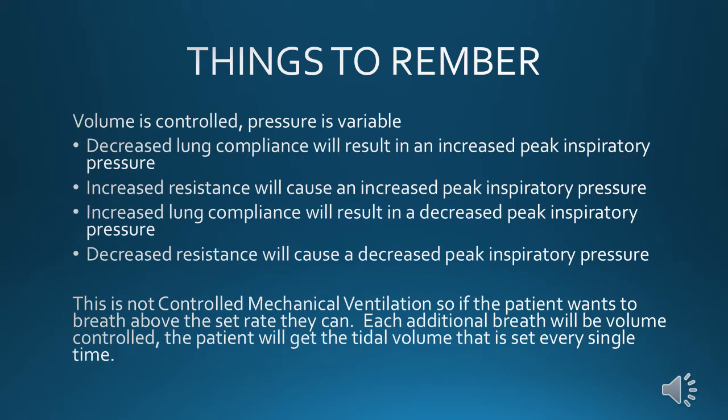Also remember, this is not controlled mechanical ventilation. We talked about this, I believe, in the very first episode. This is not CMV. So if the patient wants to breathe above the set rate, they can. Every additional breath they take is going to be volume controlled. They're going to get the set tidal volume that we set, that we showed in slide number 2.